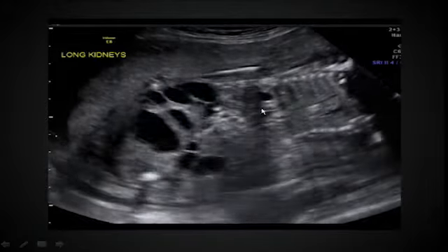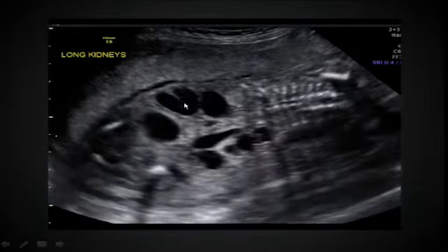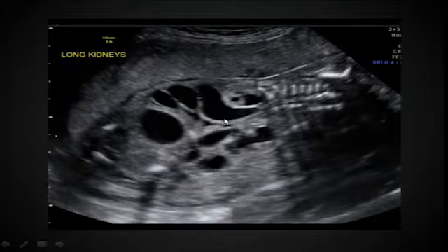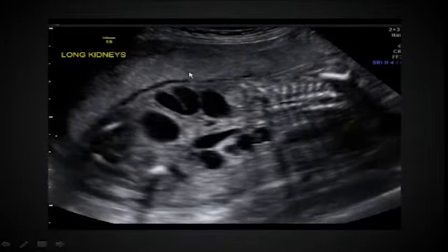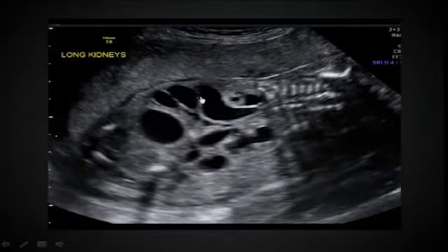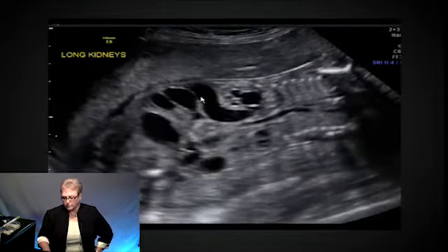And looking at those kidneys, look at these megaureters. Look at how dilated these ureters are. Normal ureters, you're not going to see. See how tortuous they are? They're just kind of winding back and forth.